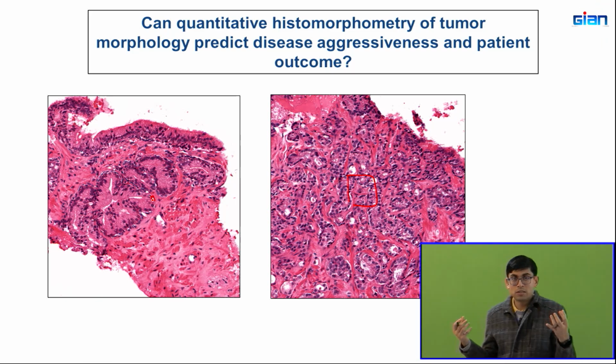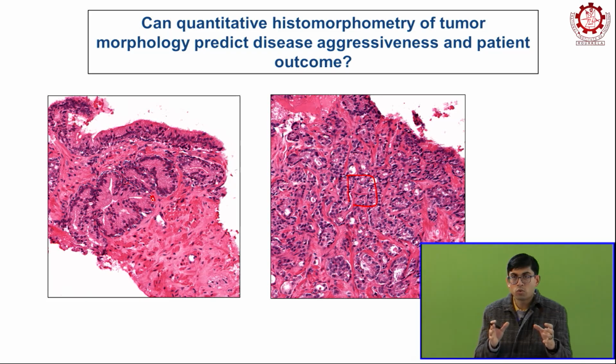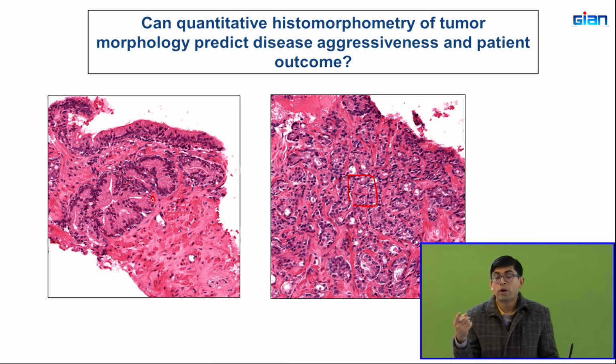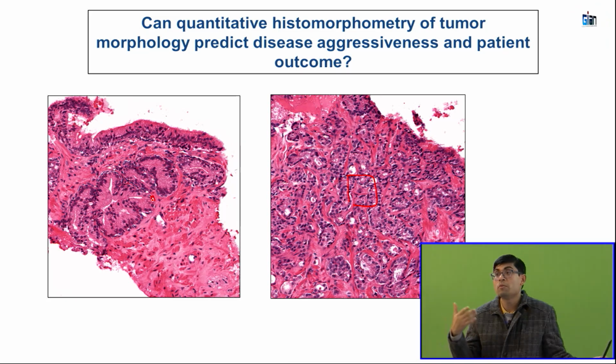It's very similar to, let's say, the camera in your phones, the photos that you take using your camera on your phones. Even though the storage mechanism is different, you have a pyramidal format here, you do not have a pyramidal format there. If you zoom further into your images on your smartphones, you'll see it gets blurry, right? But if you zoom in or zoom out of an image that has been collected using a digital pathology scanner, it is not blurry. It will still maintain that level of resolution. The resolution will still be very high because of the way these images are collected and stored.